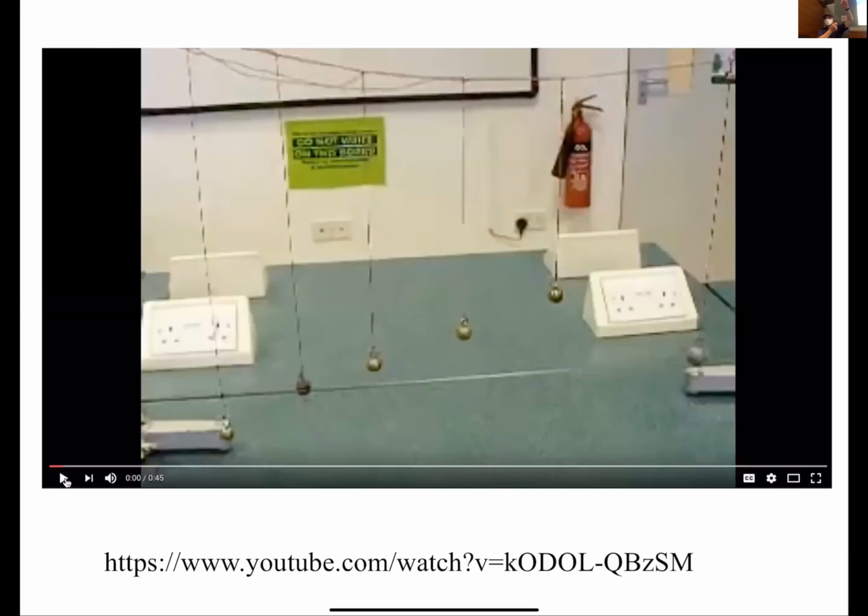So these pendulums have different frequencies of oscillation, right? What the person is going to do is set one pendulum swinging. So I think they're going to set this pendulum here swinging. So it has a certain resonant frequency, right? The question is, what's going to happen to these other ones? Are they all going to start swinging? This is essentially like a gradient. We have a gradient of frequencies here. You can think of these as different spins, each spin with a different resonant frequency, right? So the question is, how will these other spins react? Let's take a look at that.